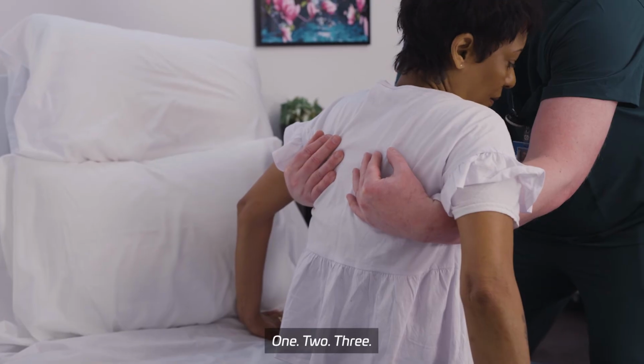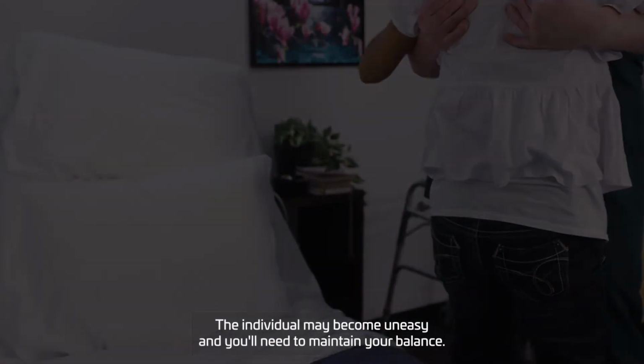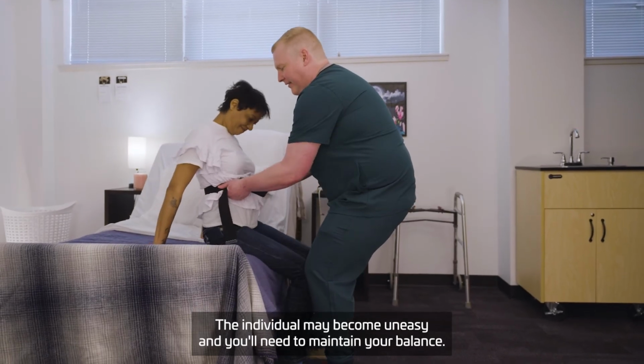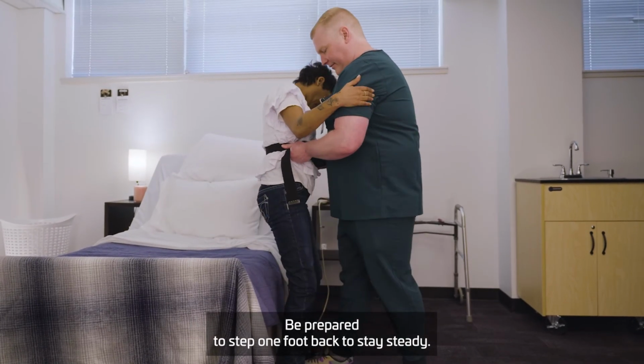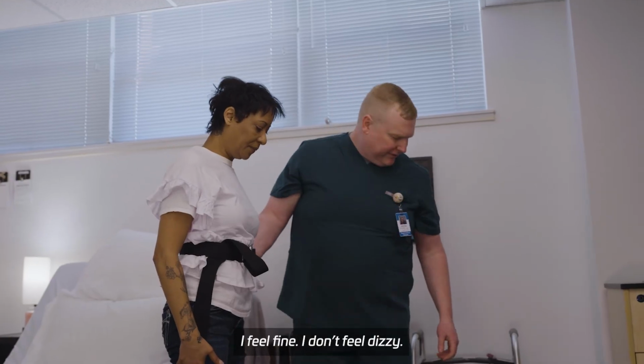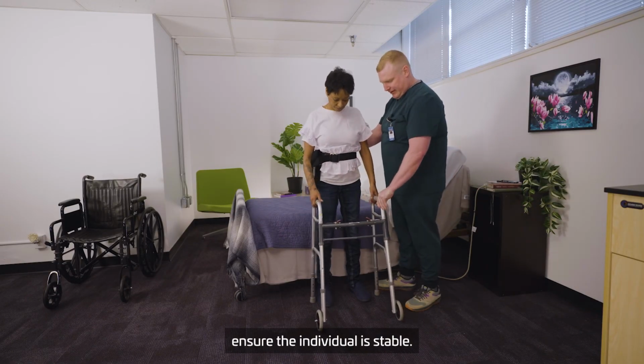All right, are you ready? Yes. 1, 2, 3. The individual may become uneasy and you'll need to maintain your balance. Be prepared to step 1 foot back to stay steady. How's that feel? I feel fine. You feel okay? I don't feel dizzy. Feeling steady? Before continuing, ensure the individual is stable.